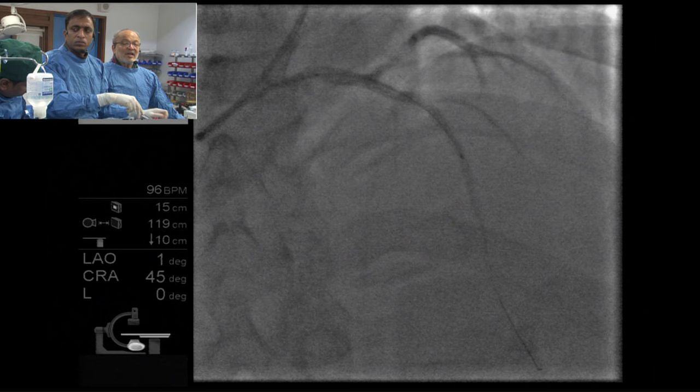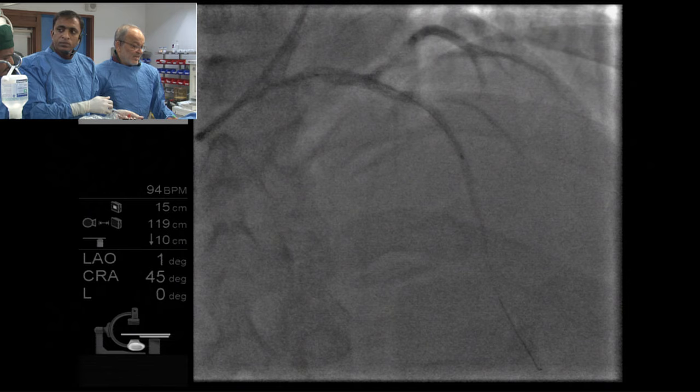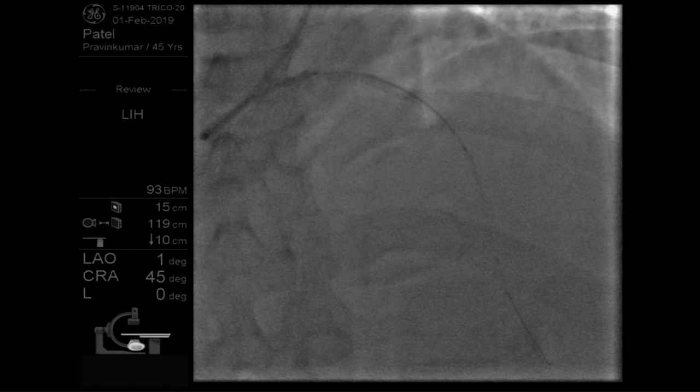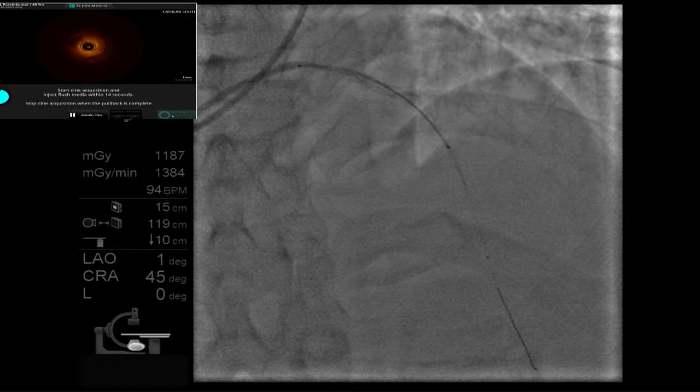Angio co-registration we are doing here. Not infrequently when patients come back with re-restenosis, you look back and the very first stent was suboptimal. Exactly. It should tell us all, we've got to get the first stent just right, with adequate preparation. I think mechanism is important. Exactly, because once you start layering multiple stents, it gets impossible.